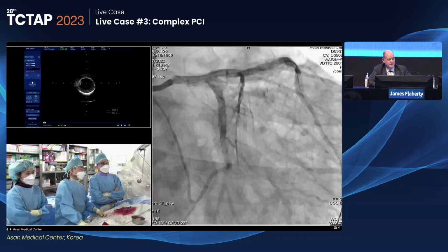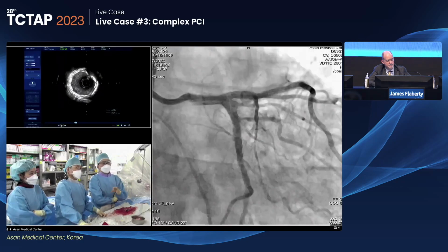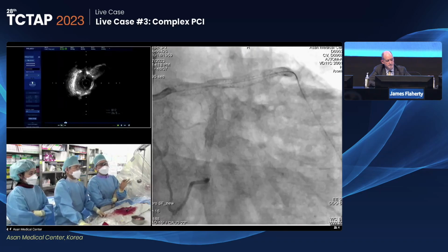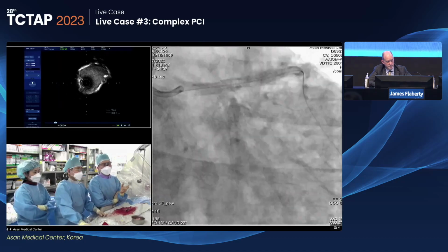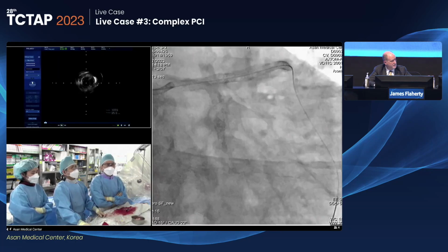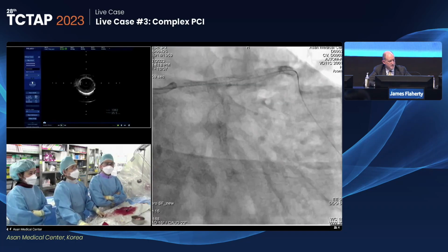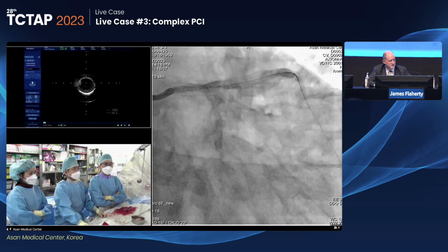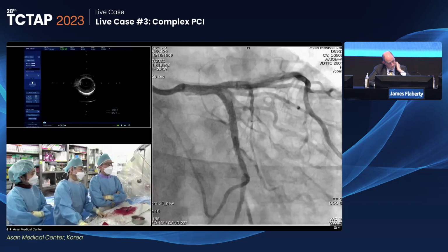I have a question to Dr. Flaherty. If I apply lithotripsy in this patient, I would apply it from the left main to LAD and left main to circumflex. Yes. And how long do you apply it? Is the patient stable during the lithotripsy? Generally, they're short runs for the pulsations. You just leave the balloon up for the time of its 6 second pulsation, 10 seconds, and several times. Okay.